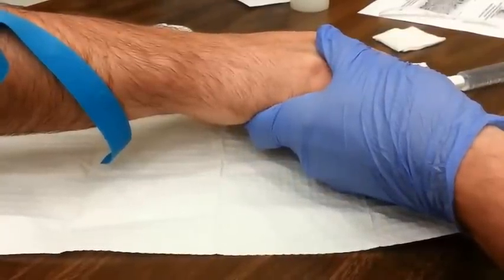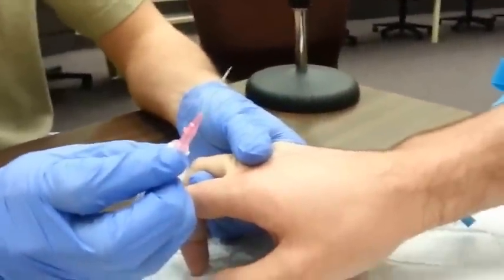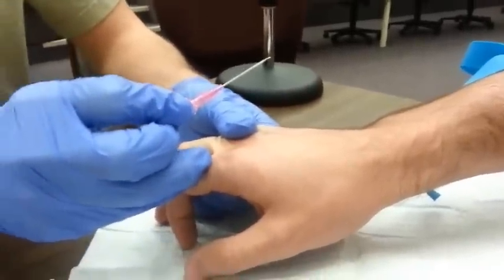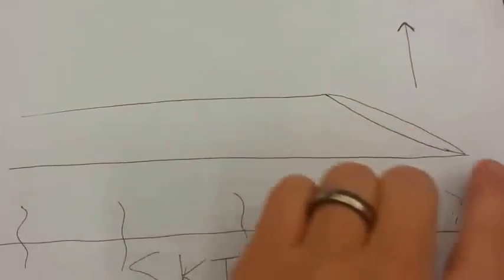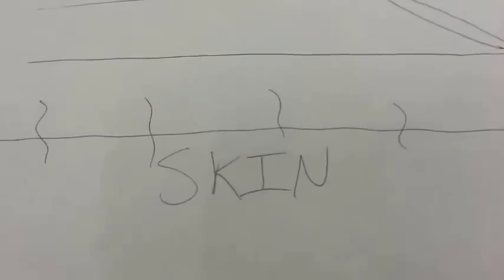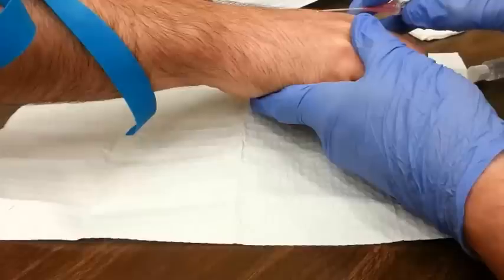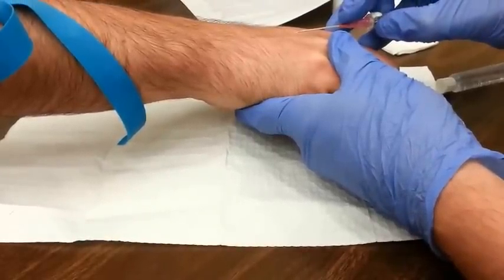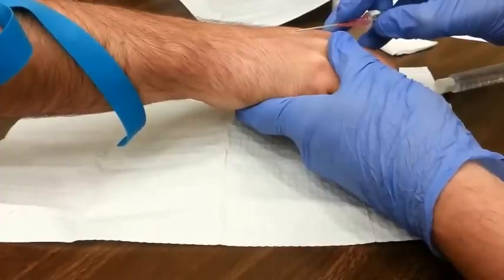Now it's time to grab your needle and catheter. These come together in your kit. The important thing to remember here is to keep the bevel up. The bevel refers to the diagonal portion of the needle, and you want it facing up away from the skin. You'll want to maintain that all the way through your puncture. With your dominant hand, keep the pointed side down closer to the skin with the rounded side or bevel facing up to the ceiling. This will allow the needle to pass easily through the skin and into a vein.